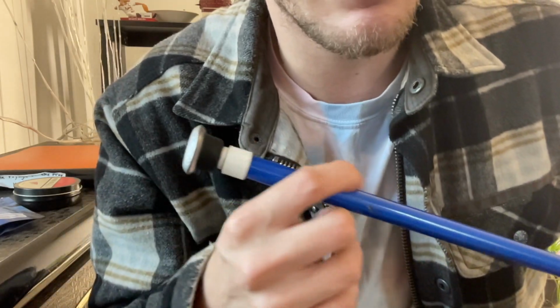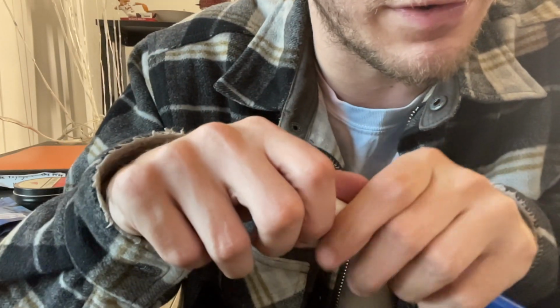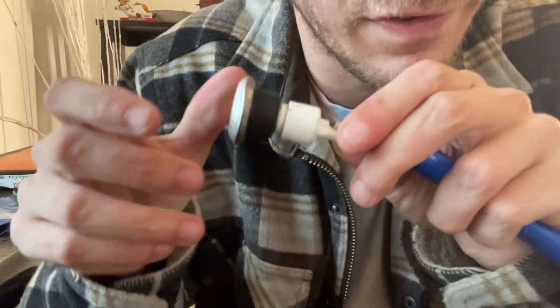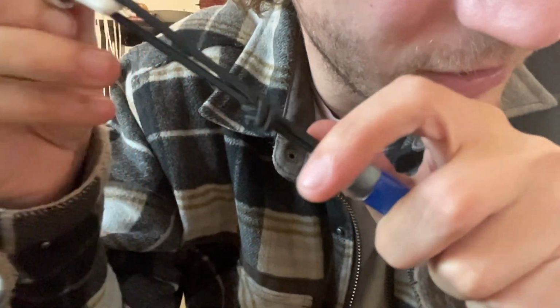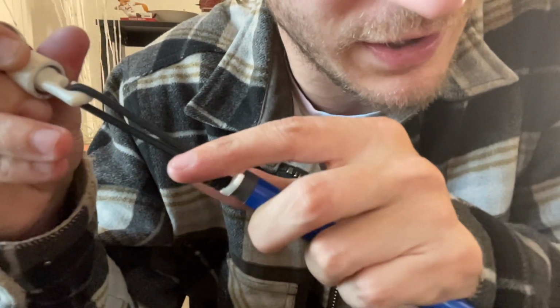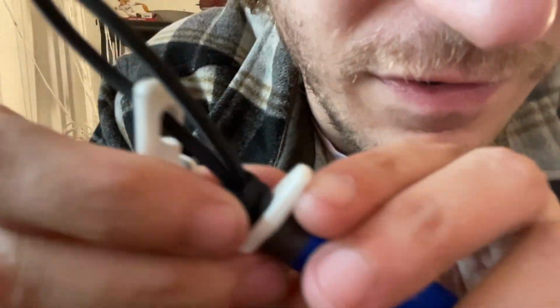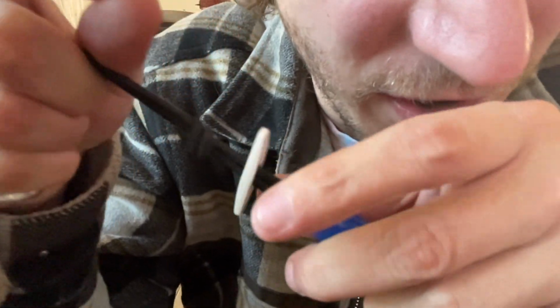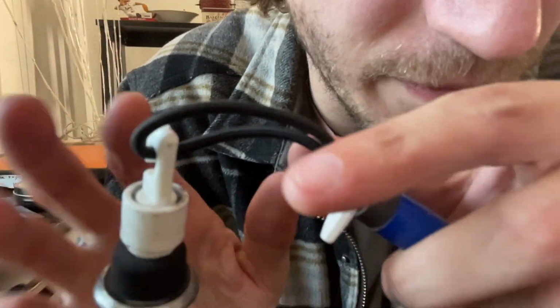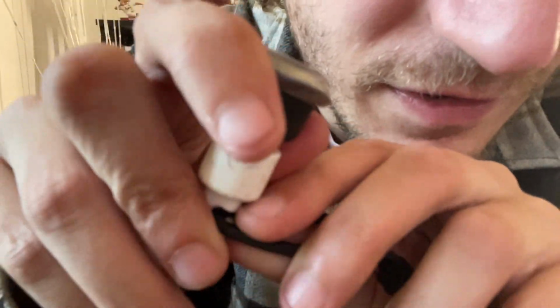And then Ambutech also offers a variety of cane tips, and these are hook-on tips. And so the nice thing is, I can pull this cane tip right out, and they put a knot in, and I just noticed this for the first time. I did not know this, so I'm learning. There's this little stopper, and it is a long T-shaped piece of plastic when it runs perpendicular. That way the knot and the piece stop this tip from going anywhere. If I wanted to replace the tip, I can slide this hook right here.